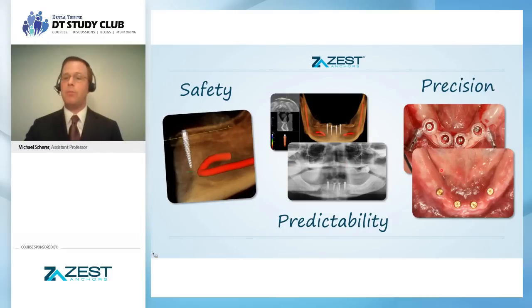Precision with a Zest LODI implant is also super critical. Now, are surgical guides perfect? No. As you see here, we did have some minor deflection. But over time, you can see this minor deflection was very reasonable. We're still way within the bony contours, because when we did our plan, we always take into consideration a safety zone, typically 2 millimeters surrounding an implant.